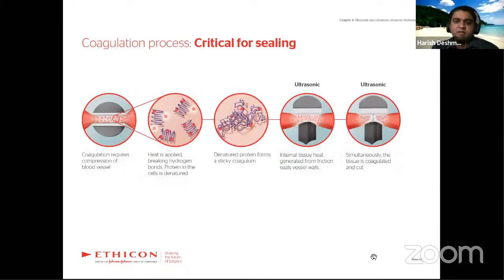So how does Harmonic do coagulation? First is the coaptation, the application of the two jaws of the Harmonic.